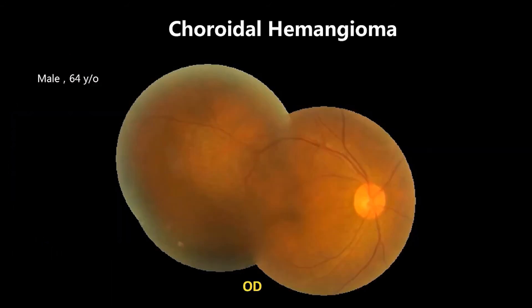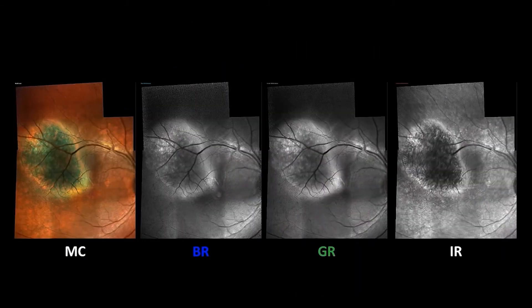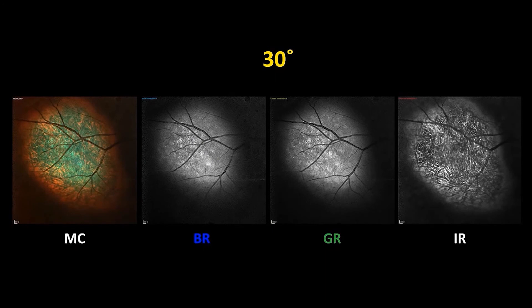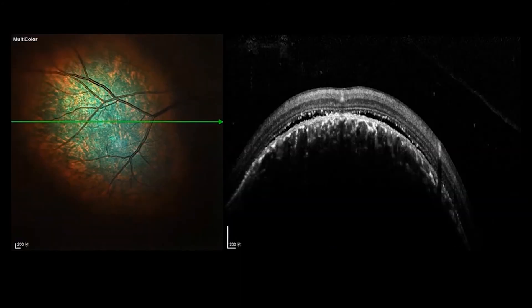For choroidal hemangioma, we can vaguely see the lesion in the superior temporal retina on color fundus photo. When we perform multicolor imaging, we can clearly observe the margin of the hemangioma and structural changes in different wavelength reflectance, as well as multicolor. They are even clearer on the 30-degree multicolor view. Plus OCT, we can confirm the diagnosis.